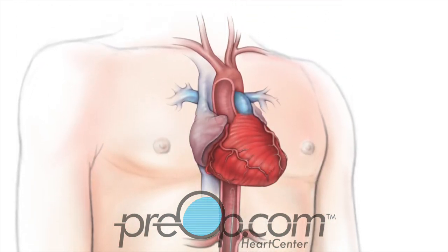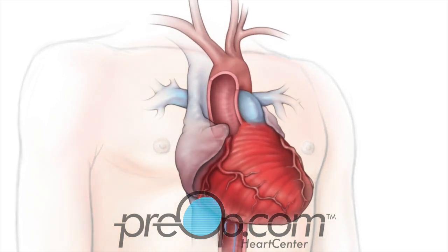Next, the long catheter is threaded through the guide in your artery up to your heart. Dye is given through the catheter, and the X-ray camera is used to see it flow through the heart. The arteries that feed oxygen to your heart, the inside walls, and the shape of your heart are examined.